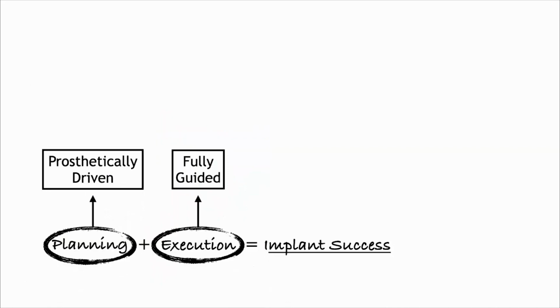And this is kind of the formula, right? So having a prosthetically driven plan with fully guided implant execution, to me, is the formula for implant success. Now, what are the tools that we need to make that happen?